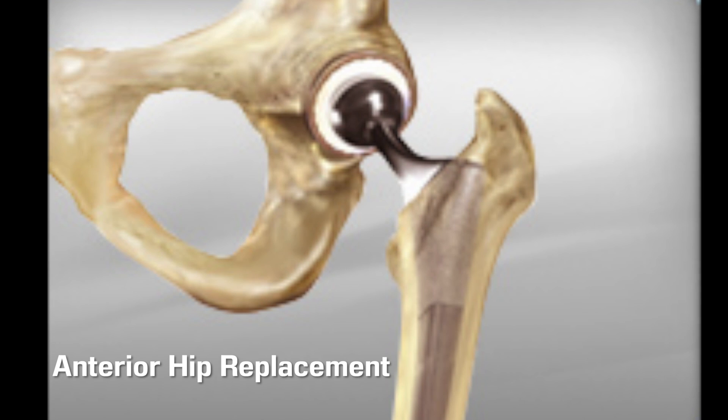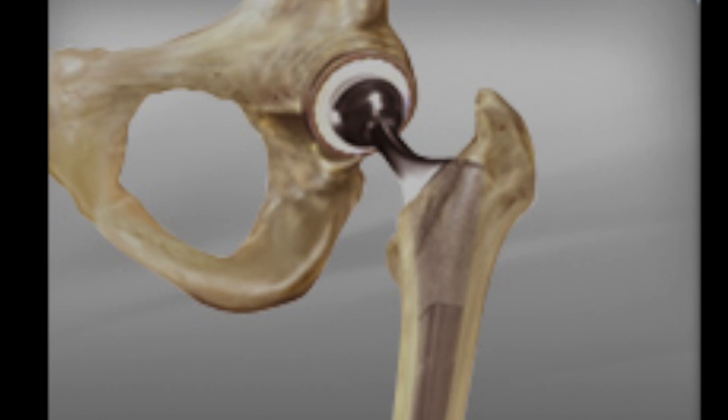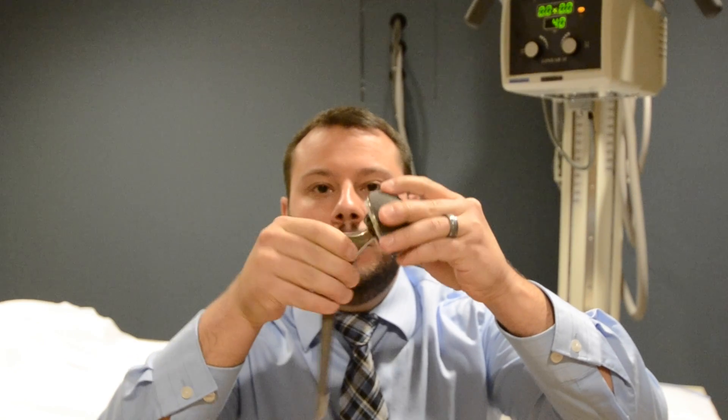On the femur side, we place a stem down in the femur with a ball made of ceramic or cobalt chrome to recreate the hip joint.